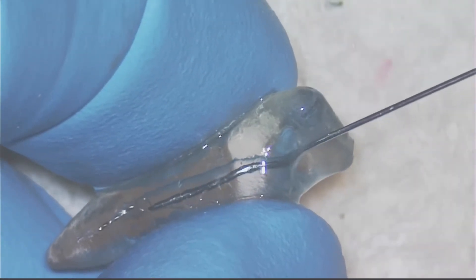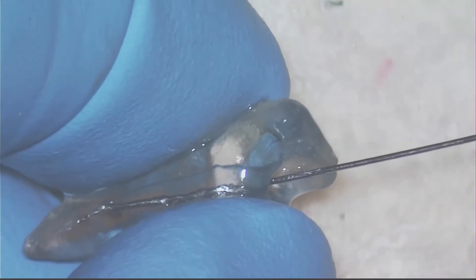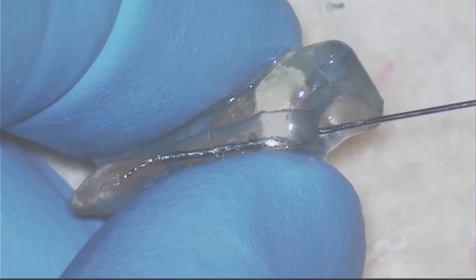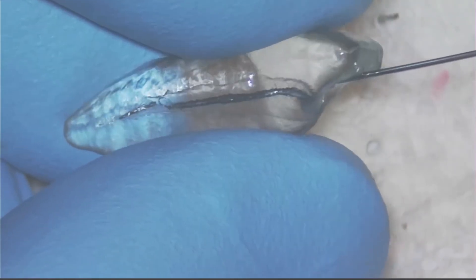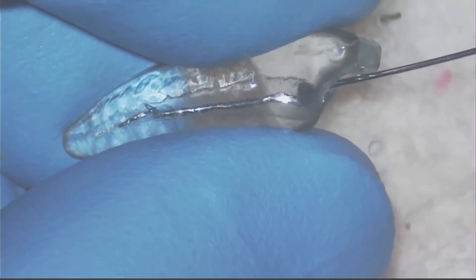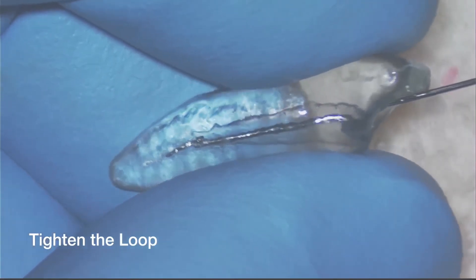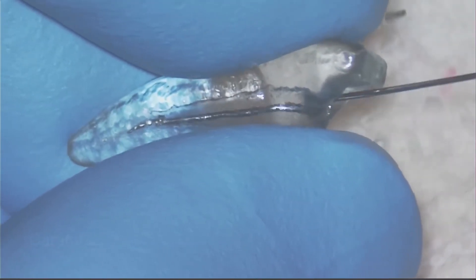It's a little big, so I'm going to make it just a tiny bit smaller. It fits in there and goes around the broken file segment. I retract it and once again we have it engaged — lightly tugging in all directions. Third time's the charm. You've got to be persistent to get broken files out. This time I remembered some advice Yoshi gave me: once I have it secured and I'm lightly tugging in different directions, give it just a little counter-clockwise turn and perhaps unthread the file. Tighten the loop here, pull it, turn it just a little bit, and it's moving.